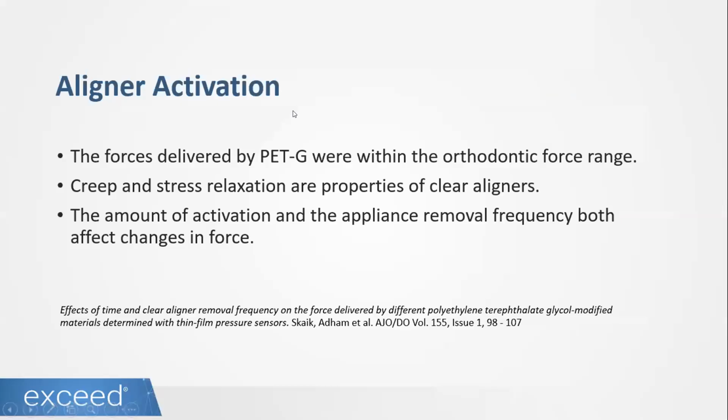So it is important that in several articles, this one by Skaik, they saw that the aligner activation was going to be reduced by the amount of activation and by the amount of times the patient removed that aligner. This means that the force that we are going to apply on those teeth is going to decrease if the patient is taking those aligners off every hour, or if you're increasing too much the velocity. So this is also important to take into consideration.